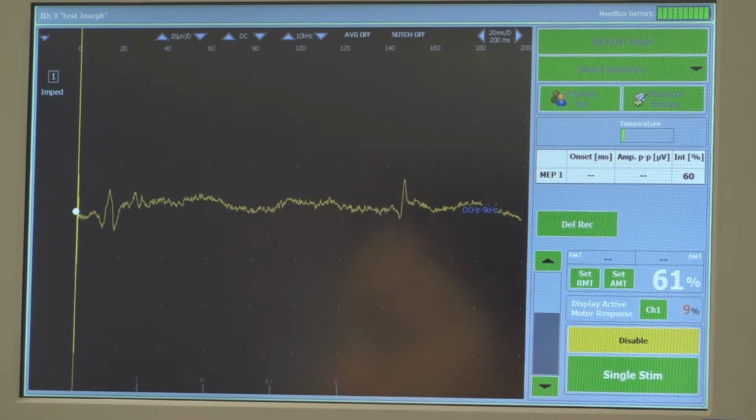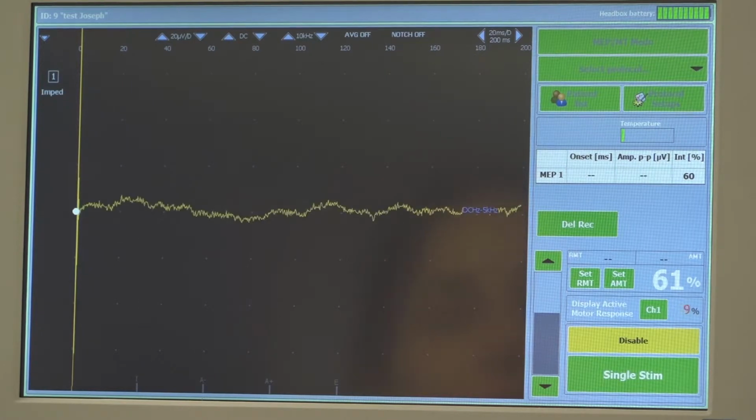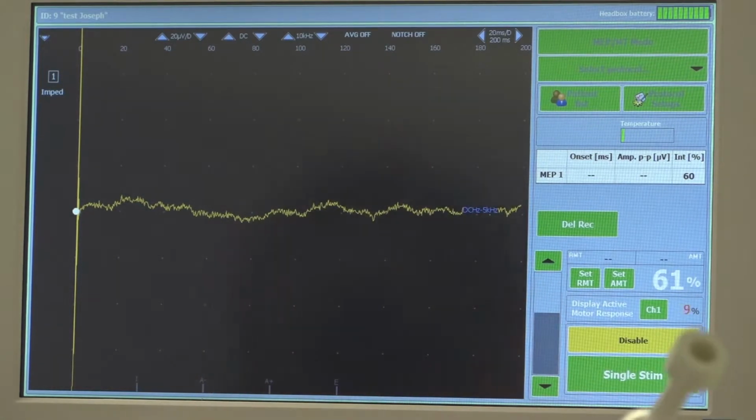This is not valid. Relax. So we wait. He relaxed too much. So we wait. But you understand what I'm doing, right?